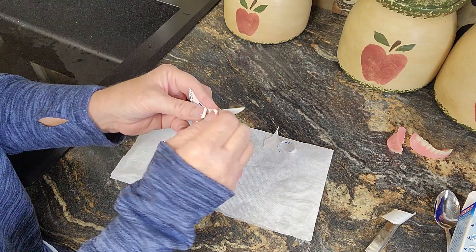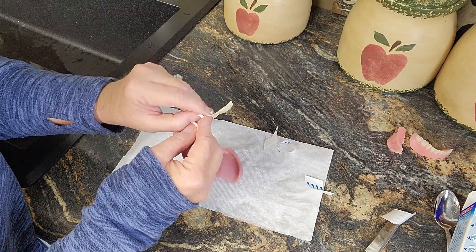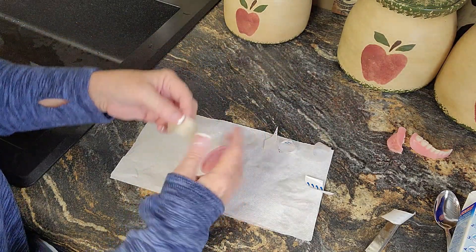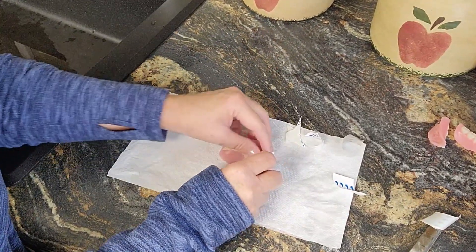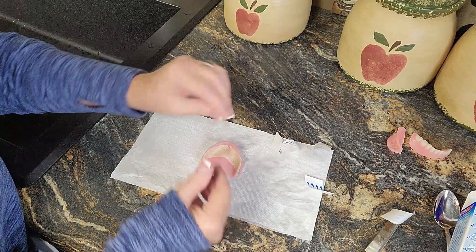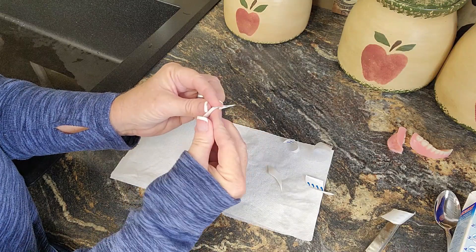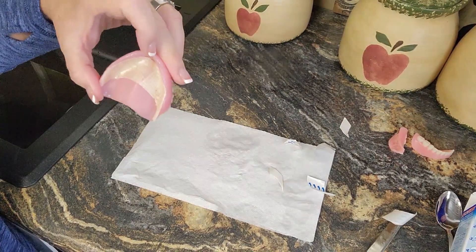If you had a huge denture you could take some of those extra pieces and put them back in. Your dentures, your rules — do what works for you the best. Let's see if I can get that in there. It worked! If you can get these out of here you can put them in the back — they are hard to open. Let's put this in my mouth and see how it works. It says put it in your mouth and don't eat or drink for 15 minutes.